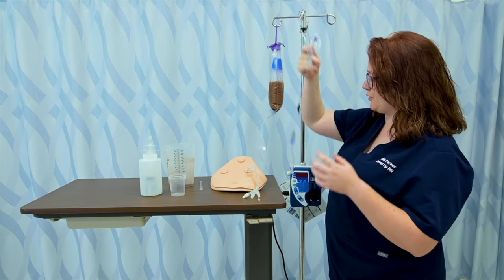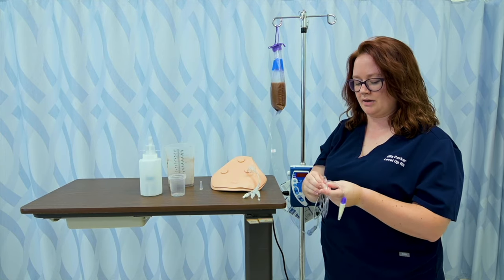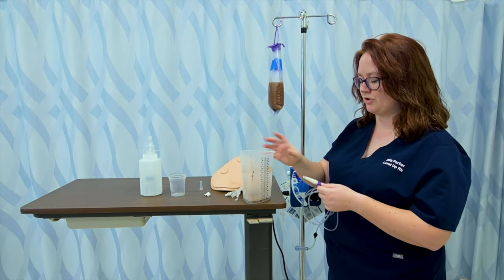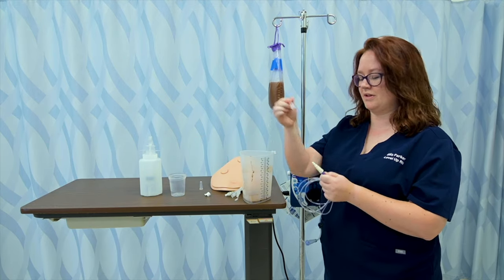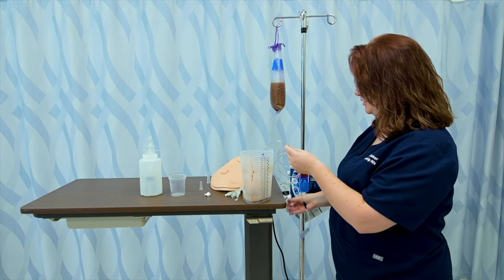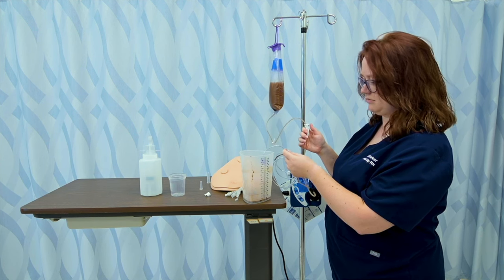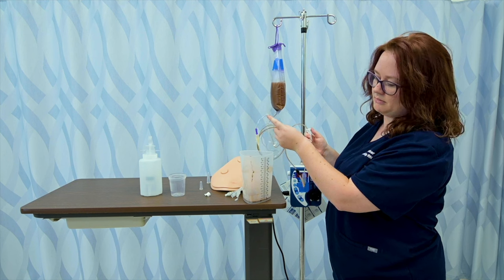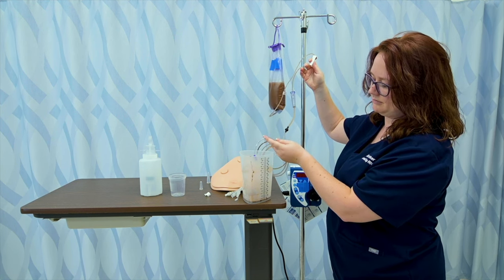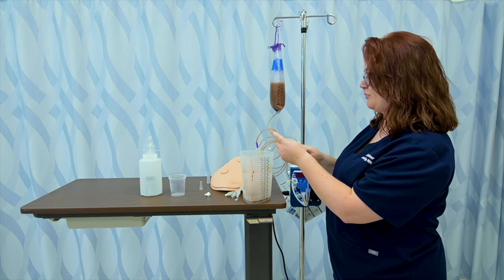Once I do that, I can either prime it with the pump or prime it without the pump, depending on what pump I'm using. I'm going to prime without it, using this graduated cylinder. I'll remove the cap, put the end over the graduated cylinder, and unclamp the tubing. It's going slow because I've got the end so high, but now I've got it primed.